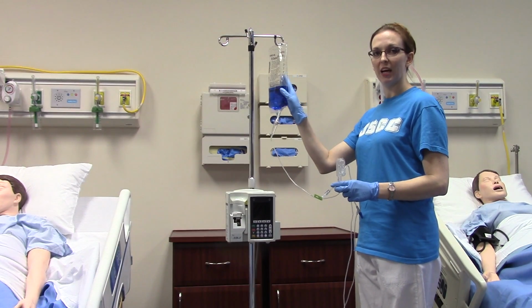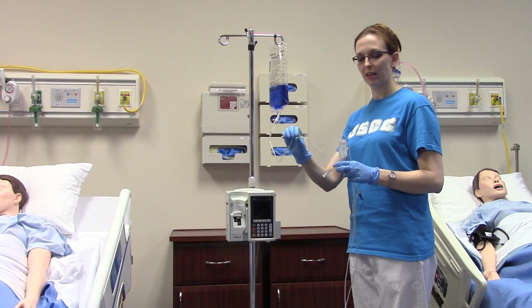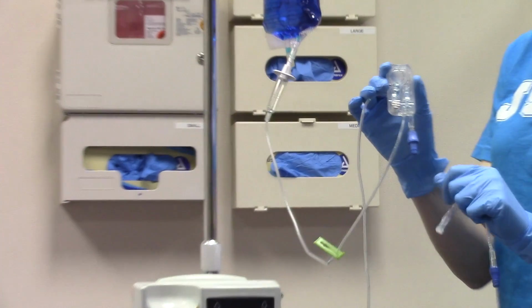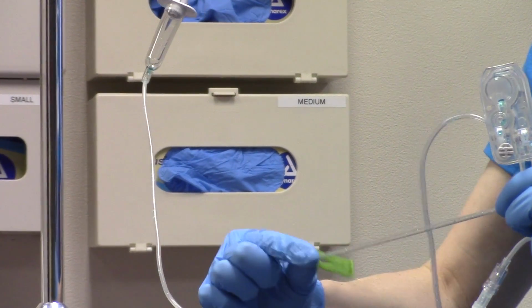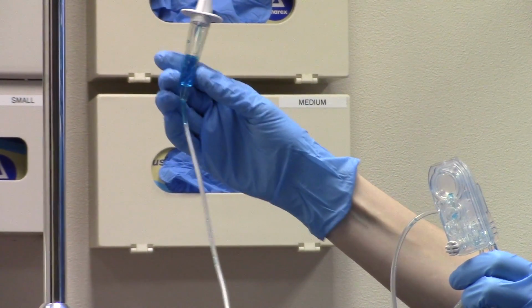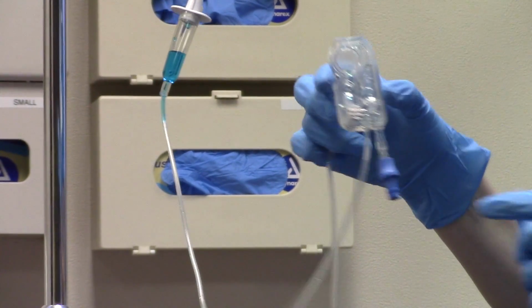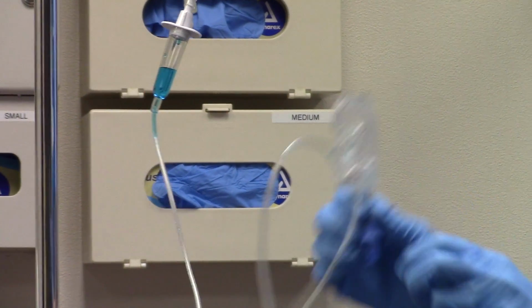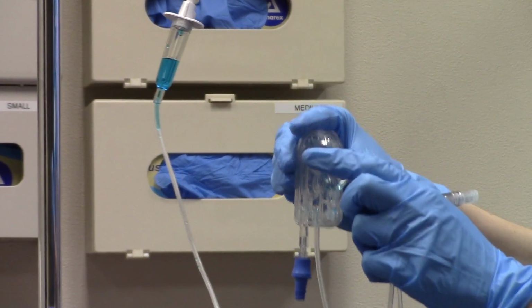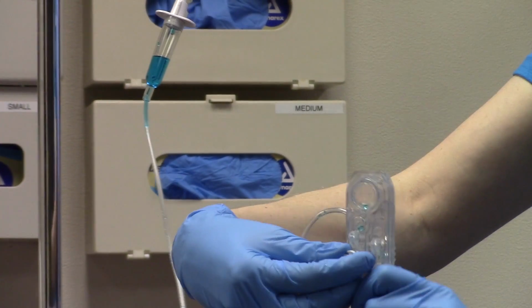Now that we have our fluid hanging, we're ready to prime the tubing. I did clamp the tubing prior to hanging it up, and I also have the white clamp here pushed in. So I'll unclamp, squeeze the drip chamber to allow fluid to fill up to the line, and holding the cassette inverted, so I'm holding it upside down, I'm going to open this clamp to allow this part of the cartridge to fill. So I'll open.